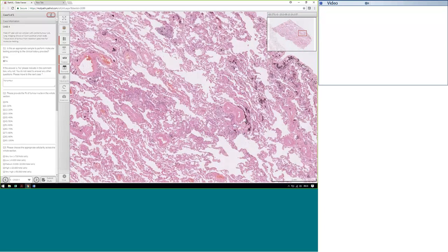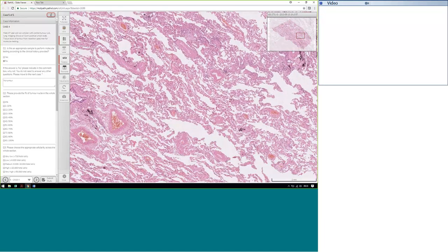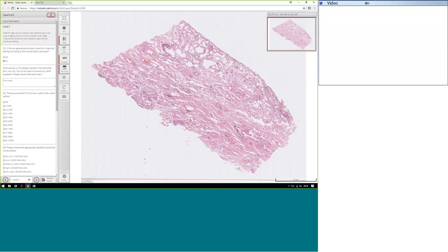Terry? Not a lot exactly to say, and I think it's a worthwhile point for these cases. Always read the clinical history, and I think clinical history in any case is the starting point. So clinical history, and does the description match the clinical history? And this is again one of the features that a lot of data sets within the college recommend, that the description matches the clinical history as an indicator of potential swapping of tissue. Otherwise, it's not for testing.